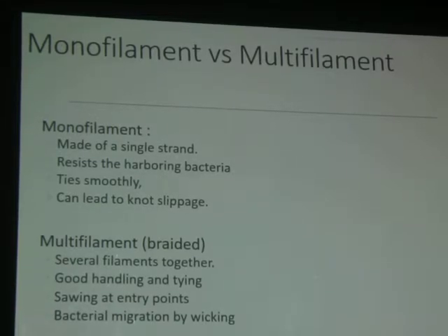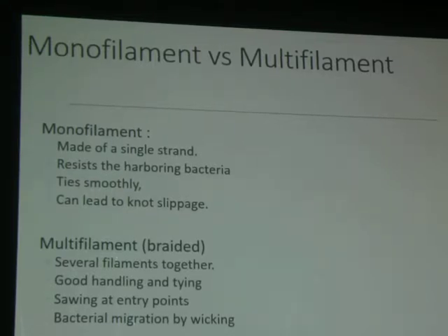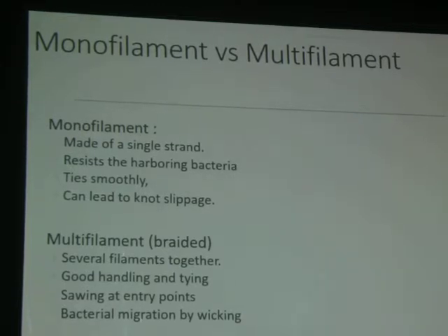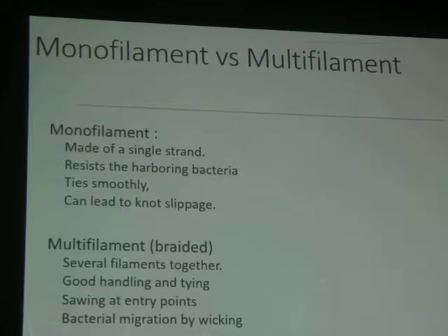The multifilament, on the other hand, is many filaments together, كأنها ضفيرة زي ما اتفقنا. It has a disadvantage that these multi-braids are like so, زي المنشار. They will cause more tissue damage during introduction through the tissues. And they will harbor bacteria due to the tissue fluid infiltrating the suture material. But they have a very good plus that they knot very strongly. لأن أنا مش بقعد بقى خيط واحد، بقعد 8 مع 8 أو 16 مع 16. So they hold a very good knot.